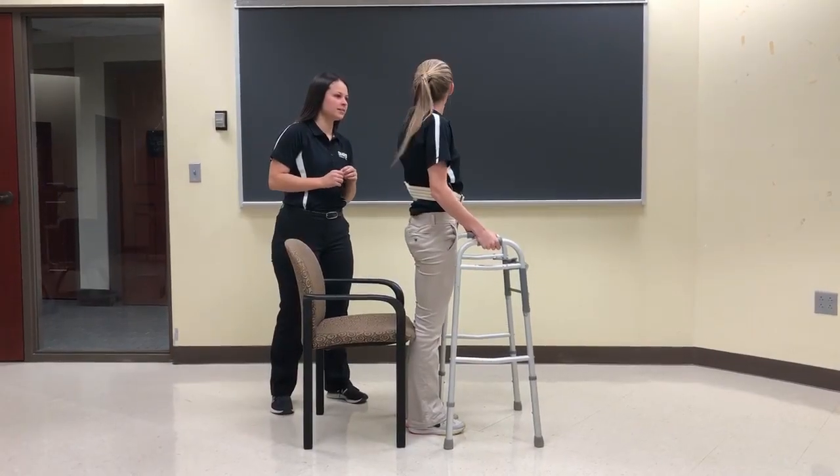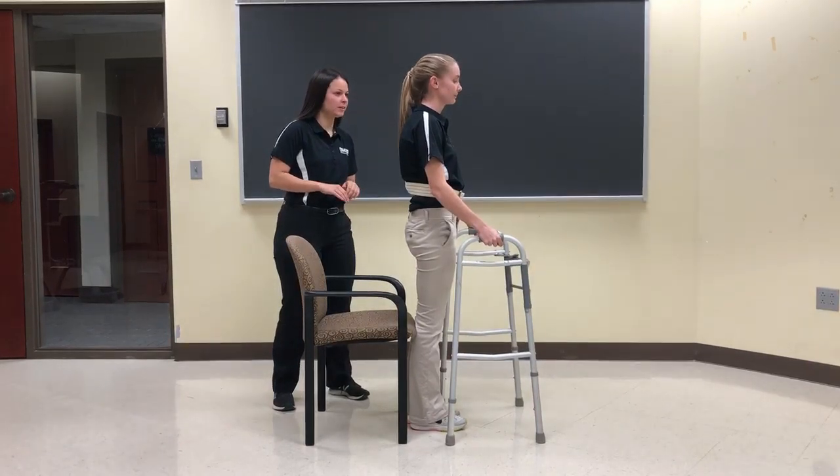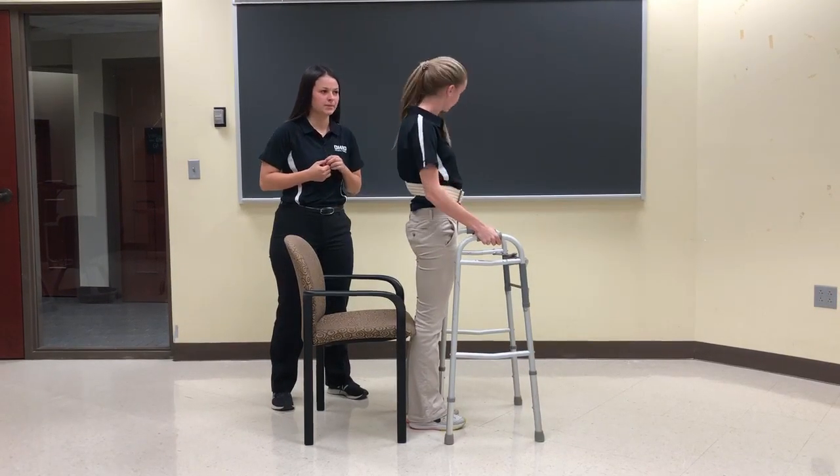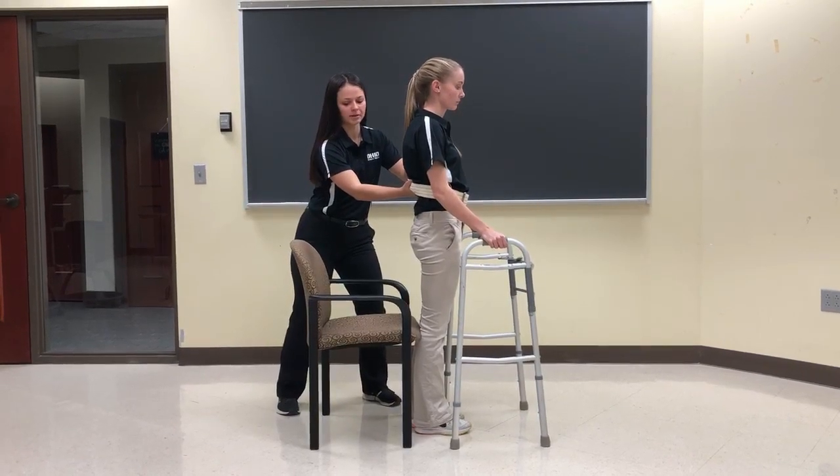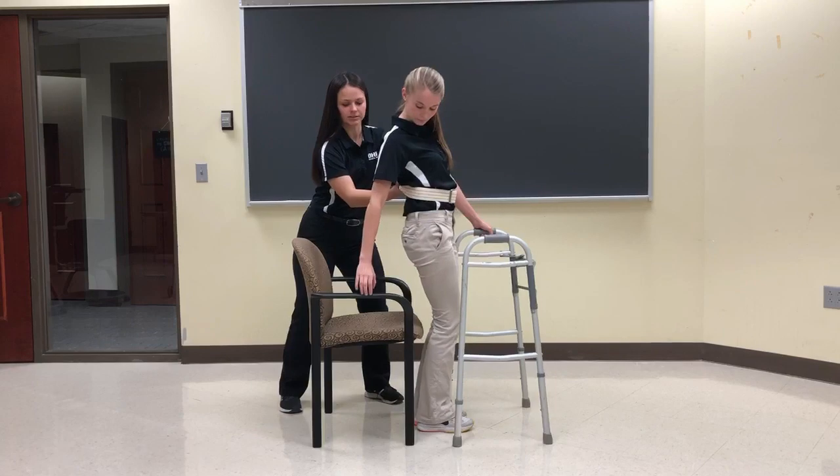All right, Caitlin, are you ready? Yep. All right, first make sure that the backs of your legs are touching the secure surface. Good. All right, I'm going to hold you back here for support. I want you to reach down with one arm at a time to the armrest of the chair and slowly lower yourself down.